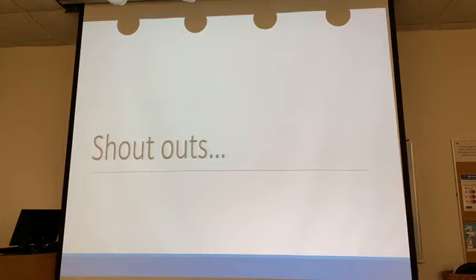Regarding your bullet point, putting it all together about the head bleeding, keeping a normal end-tidal CO2, we're talking absence of evidence of brain herniation? Yes. In a head bleed patient, if you're hypoventilating the patient, you're not bagging them enough, and their carbon dioxide is starting to build up, you're going to see vasodilation of the cerebral blood vessels, and it increases blood flow to the brain, which is not good if you're bleeding in the brain.